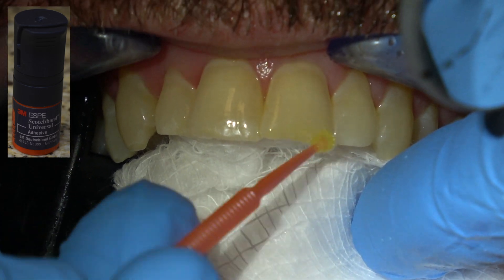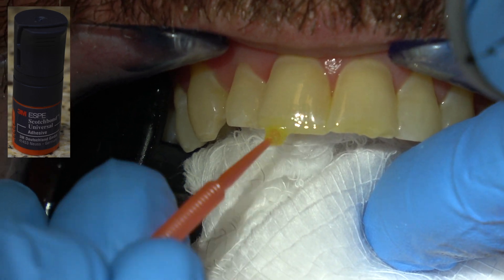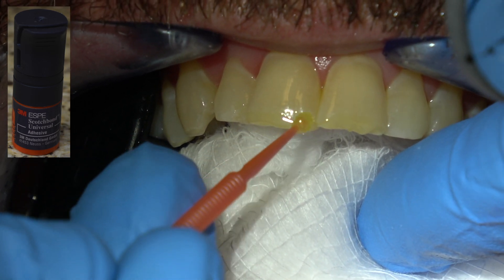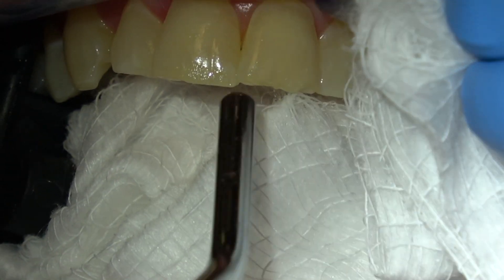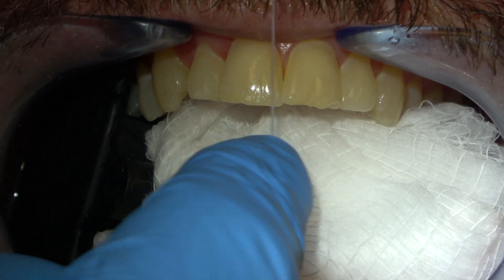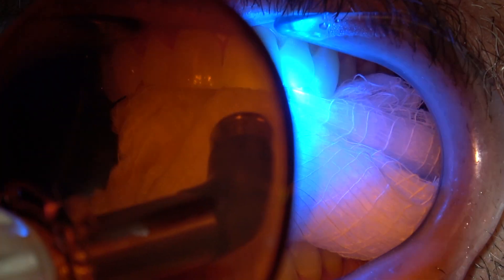This is primer adhesive. You always want to blow off the primer adhesive because it has an acetone carrier for the primer, and that carrier can compromise the bond strength. So blow that off and put a two-by-two right there so you blow that excess primer adhesive off onto the two-by-two and you don't get it all over the tissue and on the teeth. Pop some floss through the contact — be sure there's no primer adhesive in there. Then we're going to cure that — you don't have to cure it long, five to ten seconds is fine.